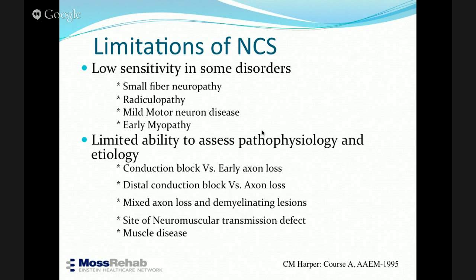In myasthenic syndrome, the problem is related to release of calcium to the peripheral muscles. And in myasthenia gravis, it is related to release of the acetylcholine and its effect on the neuromuscular junction, so it's not going to be activating the muscle fiber. Those differences you can't pick up if you do just 3 per second stimulation or 5 per second stimulation, it will look exactly the same.